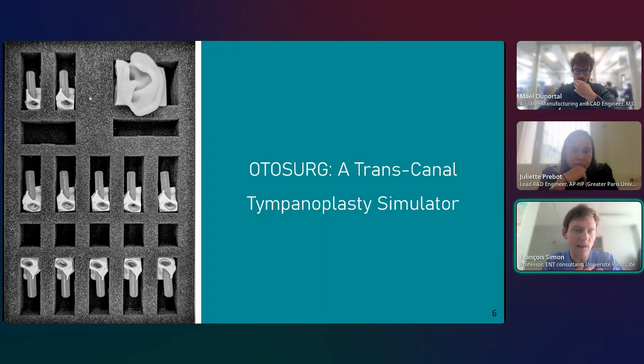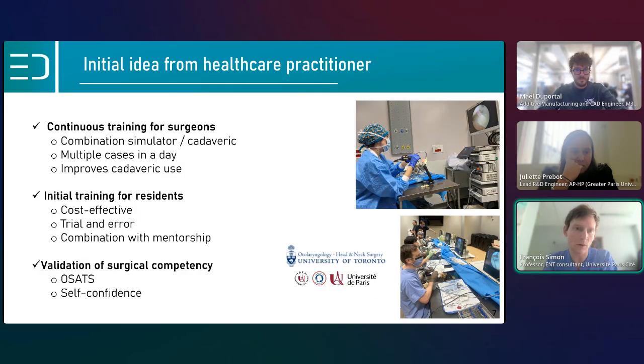And that's a completely new skill set. And that was the basis of this simulator. On one side we have residents, so they're sort of discovering the entire otologic surgery. They're a bit naive of one technique or the other, but they need something to learn on. But also experts. Some people have 20 years of experience in otology with the microscope, and they still have to learn how to switch to the endoscope. So these very experienced surgeons also need to be able to work on the simulator.